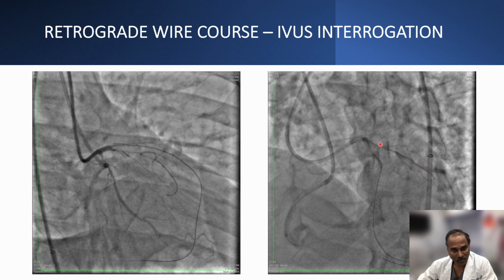And this is where we thought it's a proximal cap, but when we see the course of the vessel, it's completely away from what I thought before. So that's a problem, when you have multiple branches at the proximal cap, sometimes it really confuses you. And that's a cause for even perforation as well. So this wire we advanced, and this is where the continuation of the LAD is, it's almost close to the diagonal.